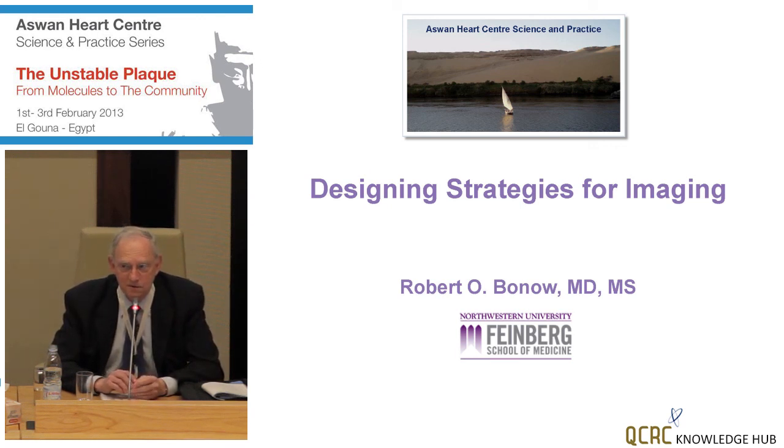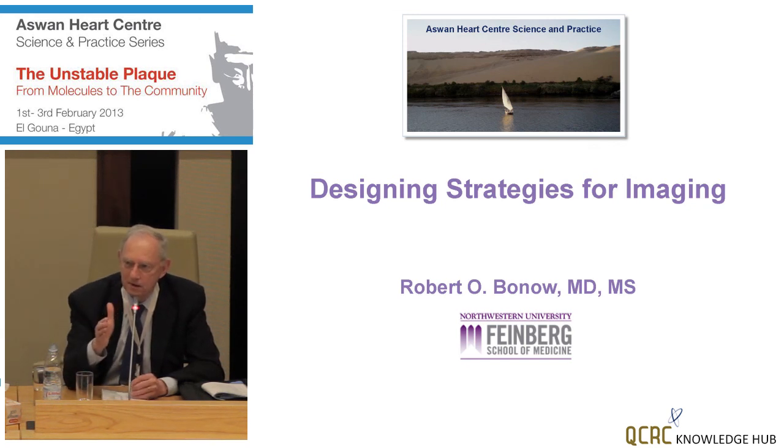Yeah, OCT is a very uniquely designed method to look at the plaque with exquisite detail, including the fibrous cap thickness, which is unique with OCT. We can also visualize thrombus much better with OCT than you can with intravascular ultrasound. And Dr. DeMaria will go into, I'm sure, greater detail with this.